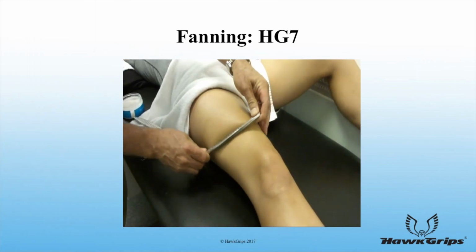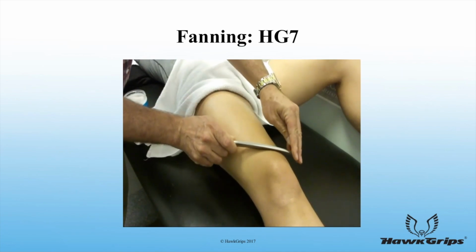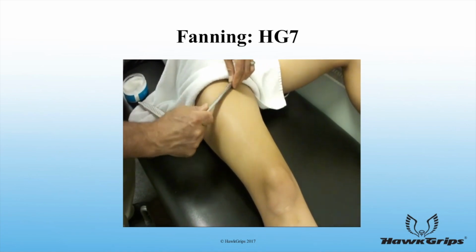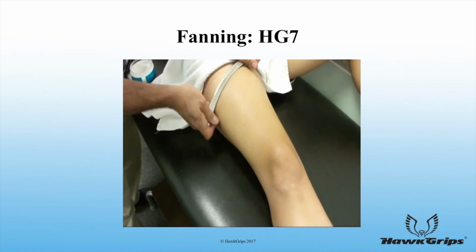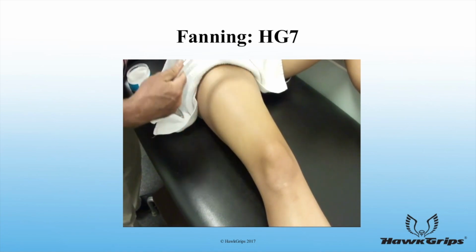In this video, both the one- and two-handed fanning strokes are demonstrated. The clinician, again, keeps one end of the instrument stationary as the opposite end moves through an arc pattern, much like a windshield wiper.